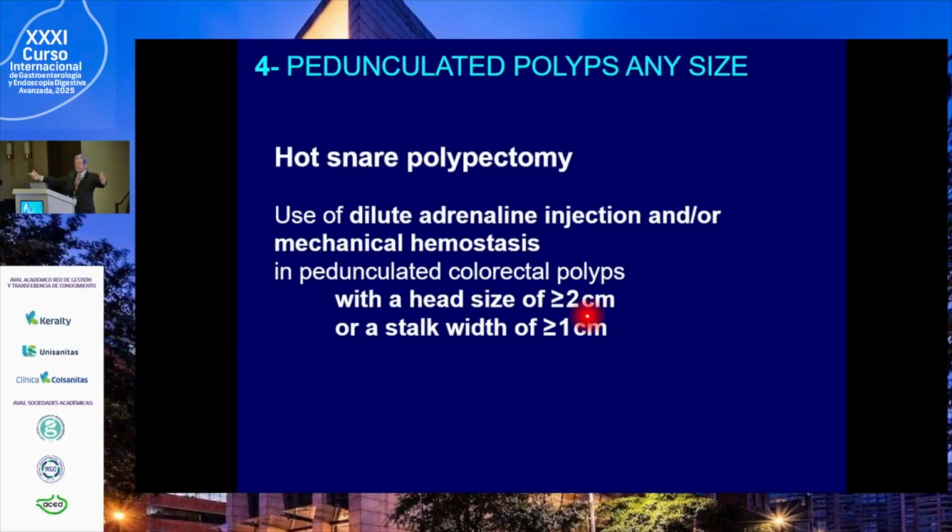You are lost. My recommendation, it's not on this slide, is to perform ESD, because then you perfectly determine the margin. I went for a large pedunculated polyp with a large stalk. I prefer to use ESD because I better control the margin, because when I insert the snare, I don't know where is the snare, okay?